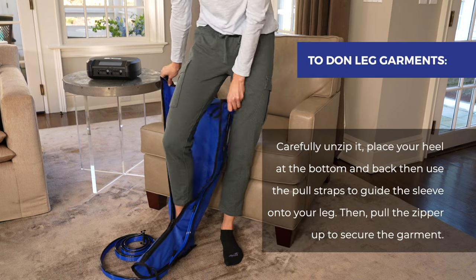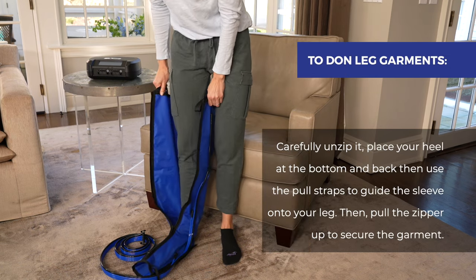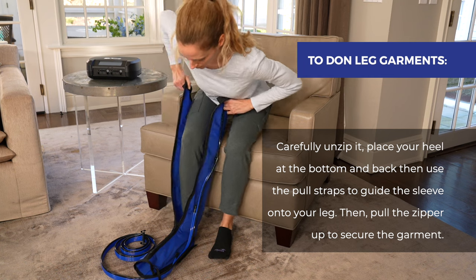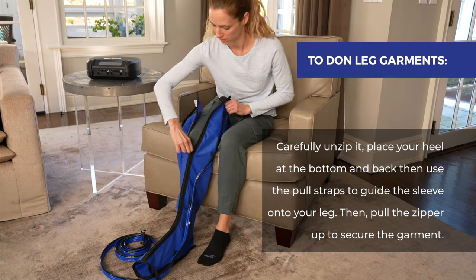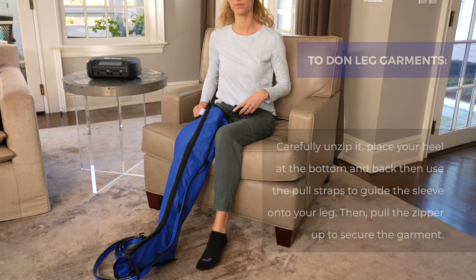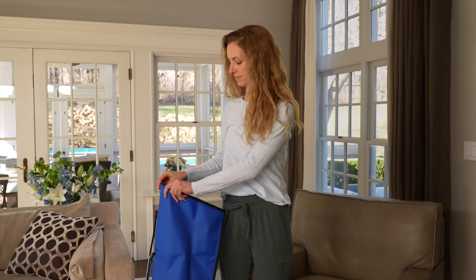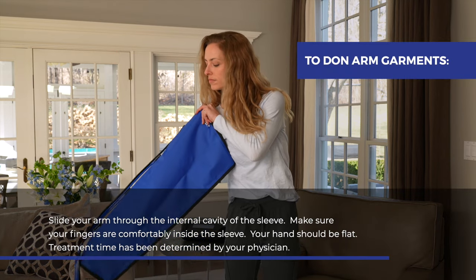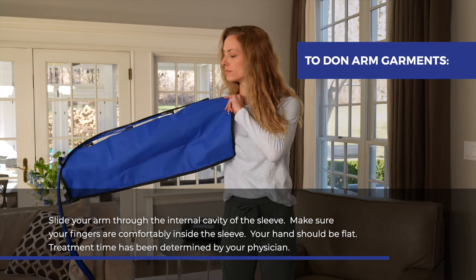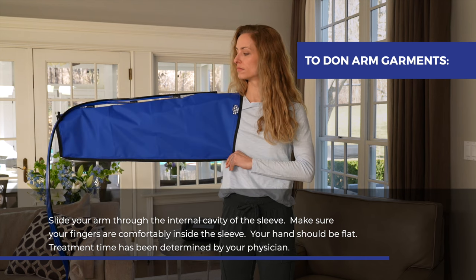To don leg garments, carefully unzip it. Place your heel at the bottom and back and use the pull-up straps to guide the sleeve onto your leg, then pull the zipper up to secure the garment. To don arm garments, slide your arm through the internal cavity of the sleeve. Make sure that your fingers are comfortably inside the sleeve and your hand should be flat.